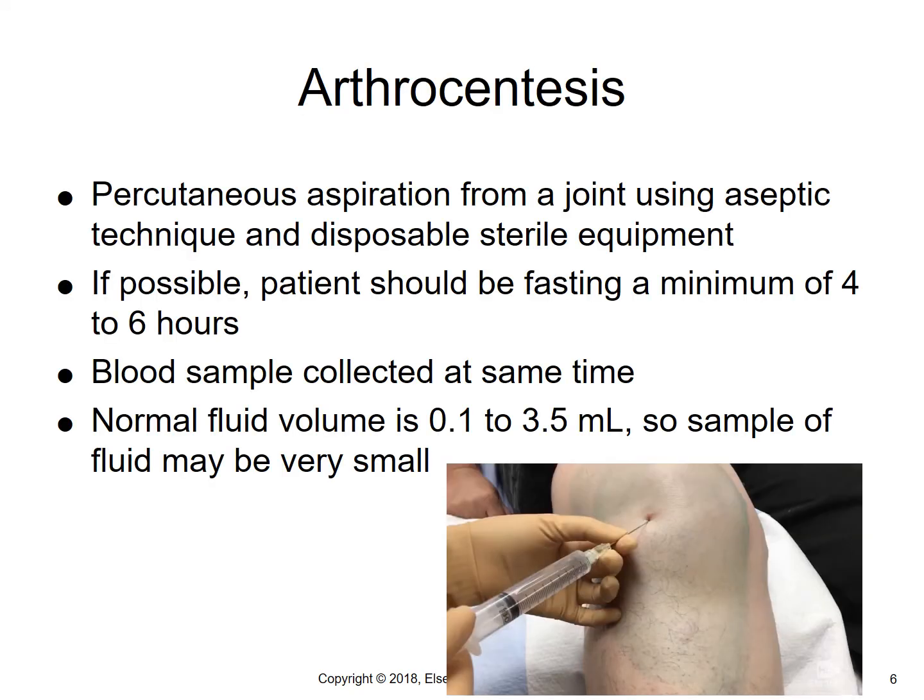Now, synovial fluid is removed by a process called arthrocentesis. It really is an aspiration of fluid through the skin using aseptic technique. Disposable needles and syringes are most often used to prevent any kind of contamination with cleaning or re-sterilization of other supplies.